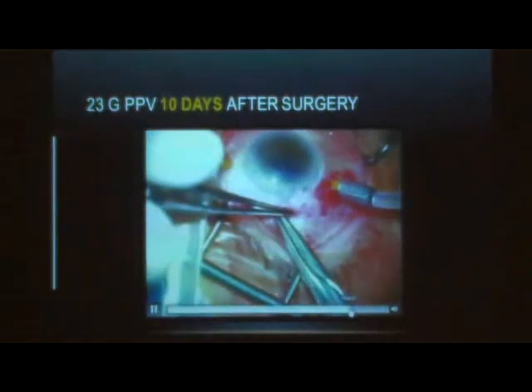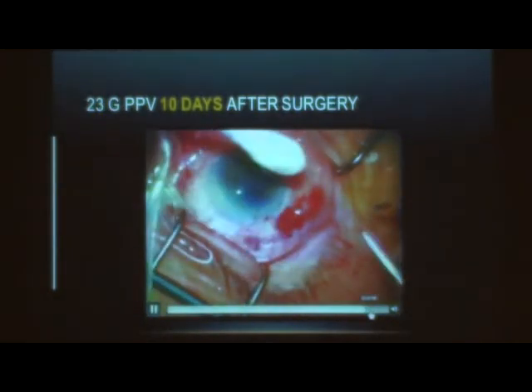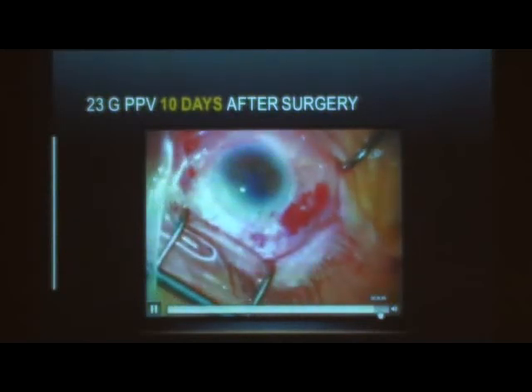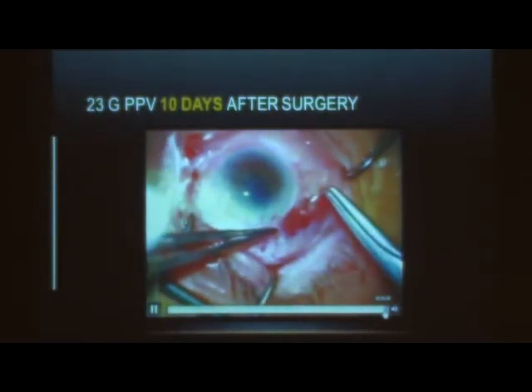And again, I put a perfluorocarbon. At the end, you can just take one suture of 7/0 Vicryl and remove your cannulas. You can put additional sutures if you want, and these are absorbable. But again, the eye is really untouched and it's very quiet post-operatively.